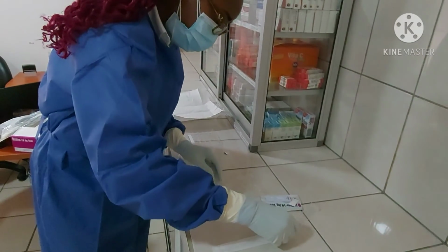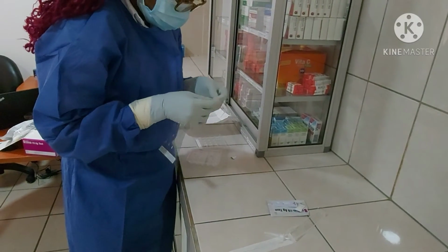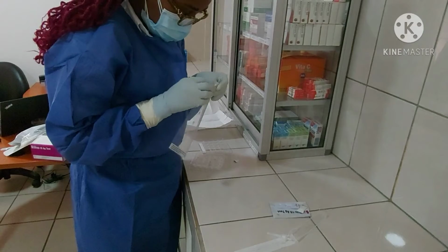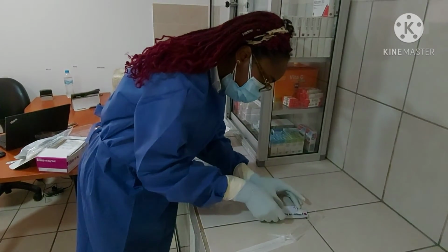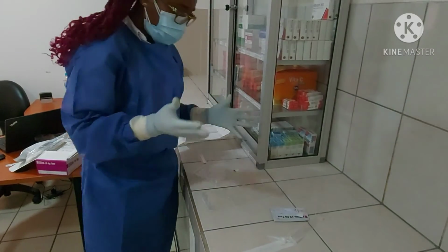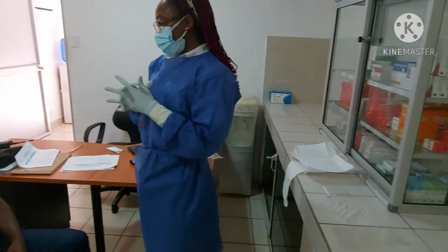After placing 3 drops of this sample mixed with the liquid, there is a transparent paper-like stuff that you're going to use to cover the cassette to make sure that the sample doesn't get contaminated. Right now we're just going to wait 15 minutes for the results to be out, and we're going to ask some questions to our patient.